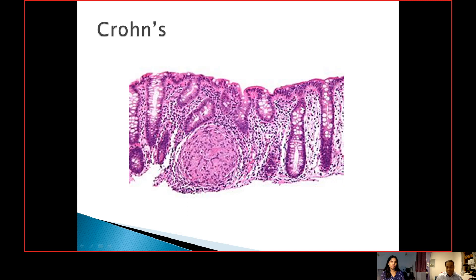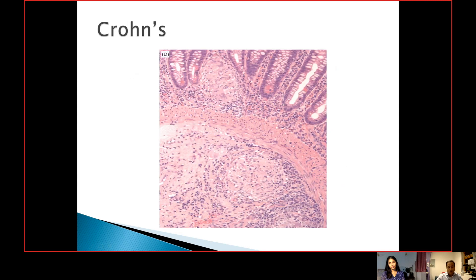What you see are these crypts which show very minimal crypt architecture distortion. At times the crypt architecture remains unremarkable as well. What is most striking here is this granuloma, and then this patchy distribution of the inflammatory cells in the lamina propria. This area here is pretty much unremarkable, whereas it's more busy on this side. On higher power, what you see is a striking feature — again, it's this granuloma, which is seen in the mucosa and also in the submucosa.